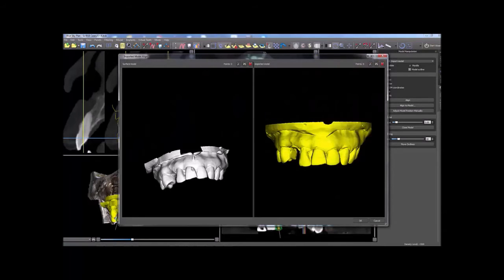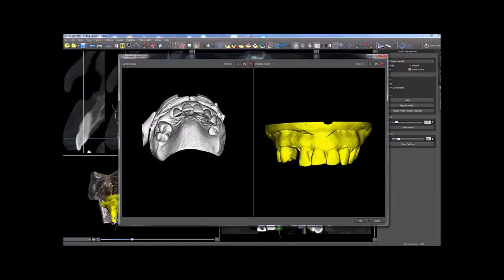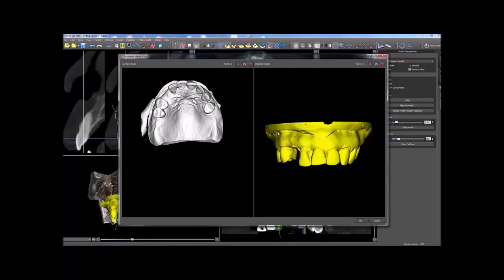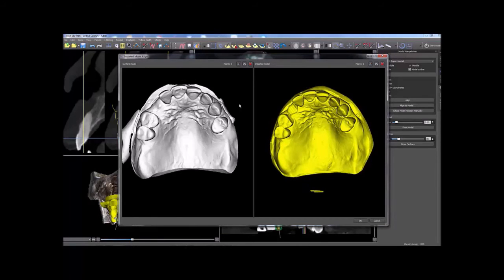After surface models are defined by the software, the imported model and the currently stitched-to CT scan model will appear side by side in the Model Align window. Use the standard Blue Sky Plan mouse functionality to rotate and resize either or both images to focus on the pertinent regions. Click on the dropper icon, hold the Shift key, and click on common landmarks that are clearly identifiable in both views in order to create an accurate stitch.